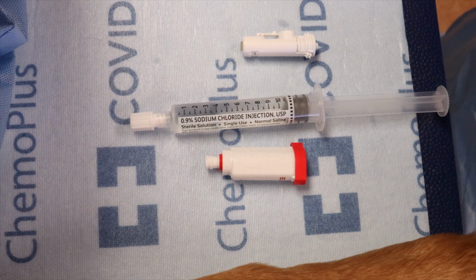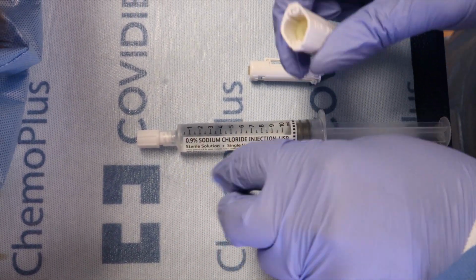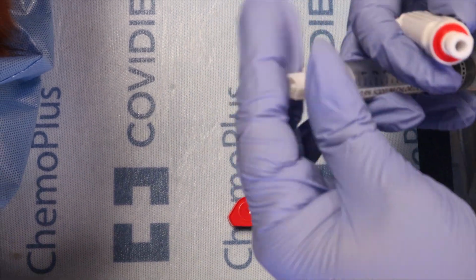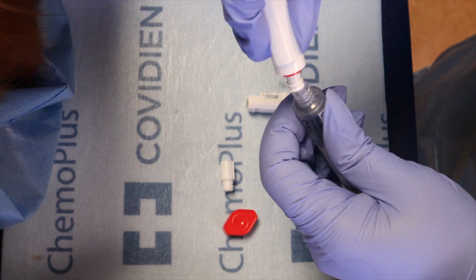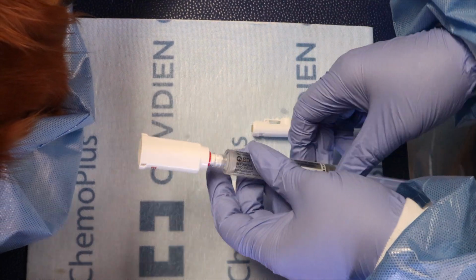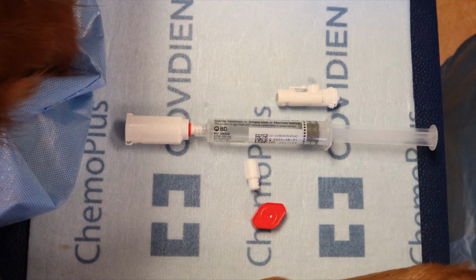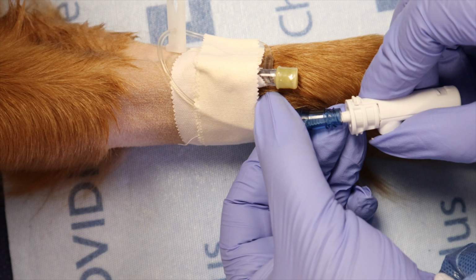We are now going to prepare the flush to be used during the chemotherapy drug administration. Locate the 10 cc flush syringe provided by VOP and remove the white cap. Attach the flush syringe to the EquiShield female lure lock connector and set aside. You are now ready to administer your patient's chemotherapy dose.